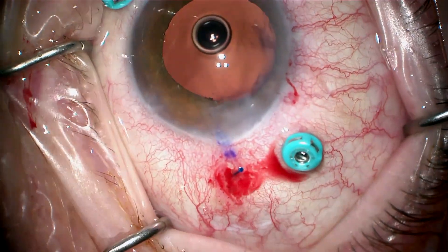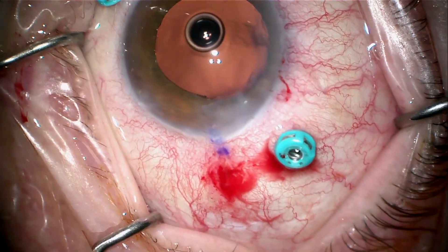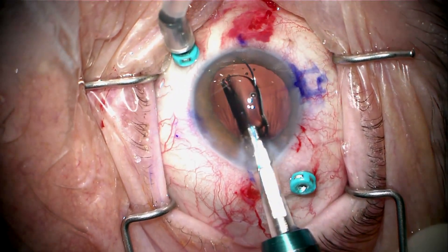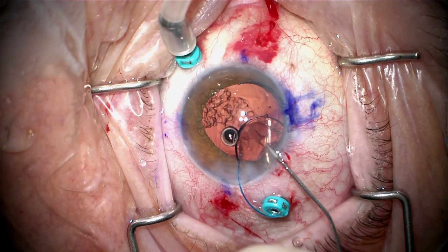The other haptic is disinserted. I'll pick the tip out, grab it, and pull it out — and now the lens is completely removed. We're now injecting our new lens, which is an AR-40, which I've had very good success with. I'm no longer using the Zeiss lens for this.